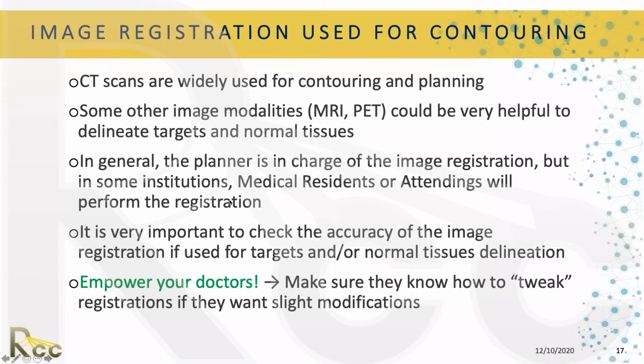In general, and again, it varies a little bit between institutes, it's the planner who does the image registration, and in other institutions the medical resident or the attending will perform the registration. It depends.